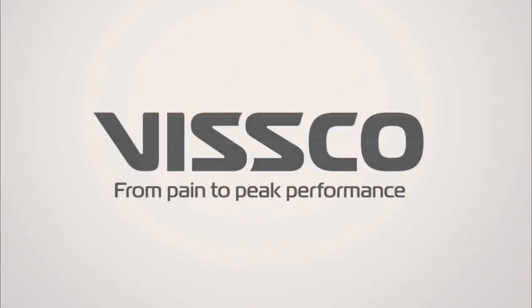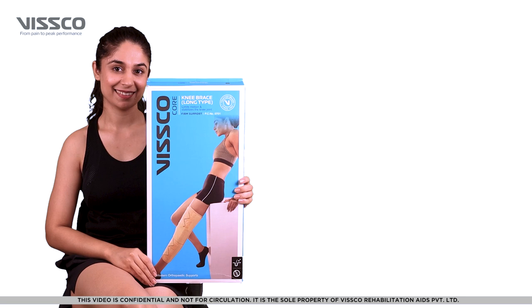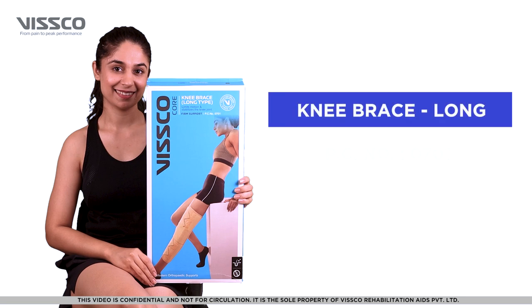Hi there, greetings from VSCO. Let us now see how to wear the VSCO Long Knee Brace, Product Code 0701.